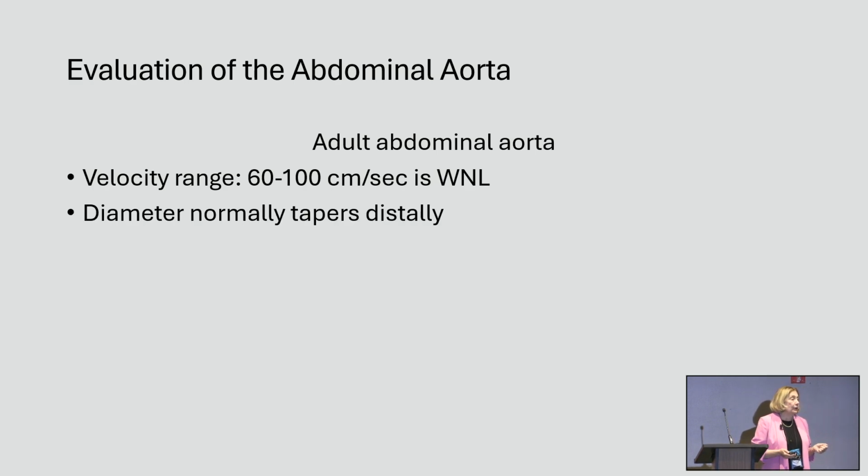So the diameter, and these are the points you want to think about. The diameter should taper as you go distally. So the diameter should get smaller as you go distally. I have seen some that don't, and they just stay that way. So as has been said in most of the lectures so far, it's not just what do I see, where does it fall in the criteria, but also what does it mean for that patient.